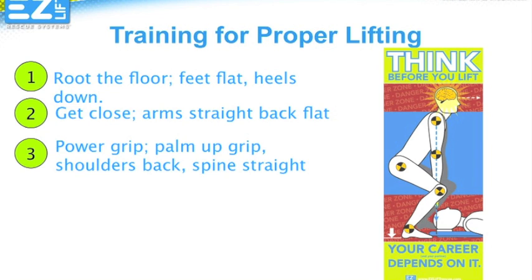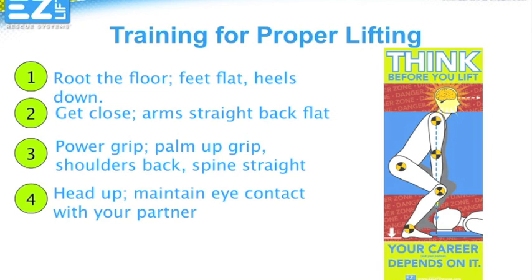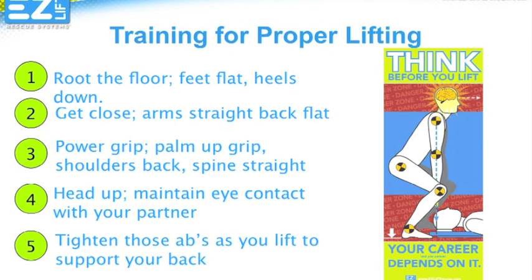We suggest a palm-up grip called the power grip because it helps keep your shoulders back and your back straight. At all times, keep eye contact with your partner. This will ensure you are protecting each other by checking each other, and it will keep you from looking down and loading your back as you lift. Last, as you lift, brace your abdominal wall. This will help support your back as you lift straight up.